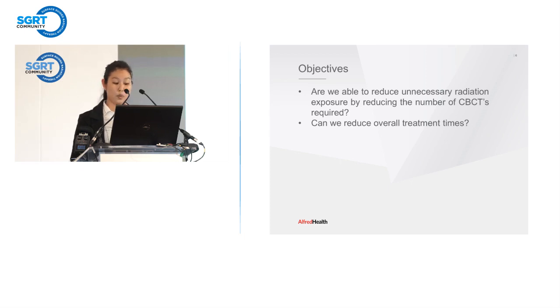So then the questions were brought forward. Could we reduce the unnecessary radiation exposure that these patients were having to receive by reducing the number of cone beam CTs required? And if we didn't have to take so many cone beam CTs, can we reduce the overall amount of time that these patients need to spend on the bed?